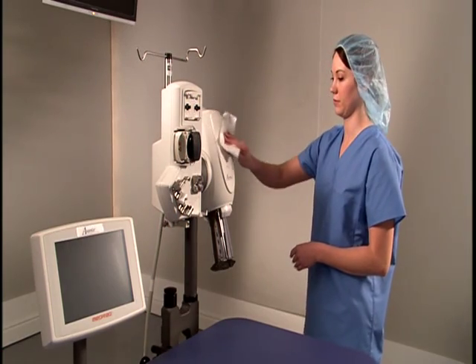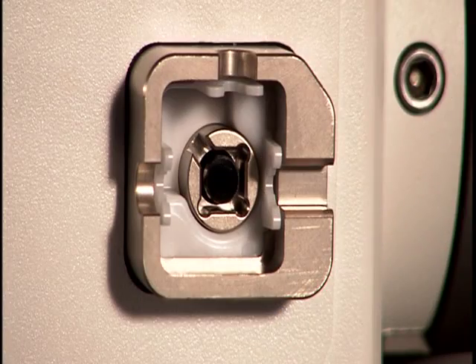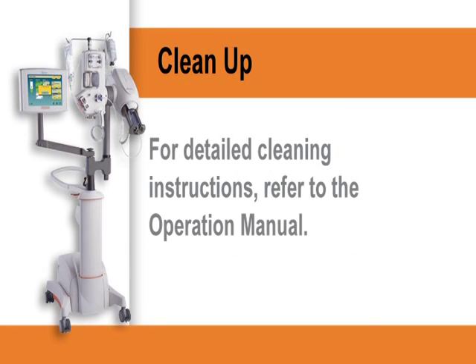When cleaning the FCM, ensure that the backlighting on the drip sensor chambers, the gross air detectors, the CFCV, and the peristaltic pump are free of contrast buildup to ensure proper operation. In the event of contact with body fluids, spills, or contamination, follow your institution's decontamination processes. For detailed cleaning instructions, refer to the operation manual.